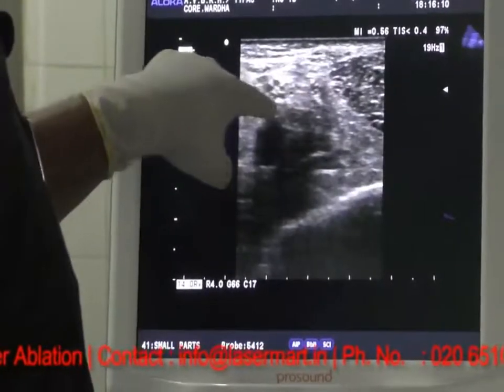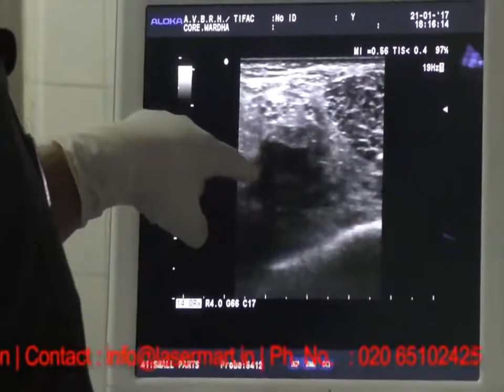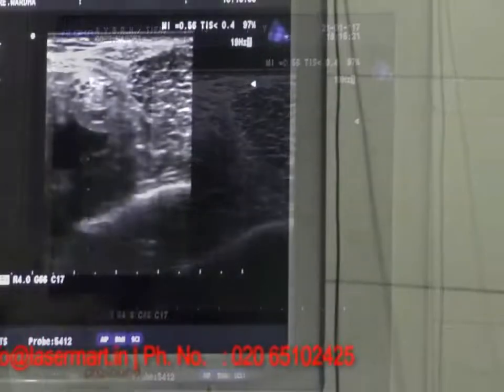You can visualize this clearly over here, and also with reference to the vessels, it is just above the popliteal vein. This one is the popliteal artery and this one is the sciatic nerve at the popliteal fossa.